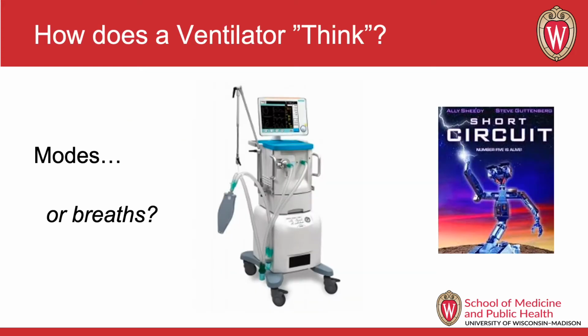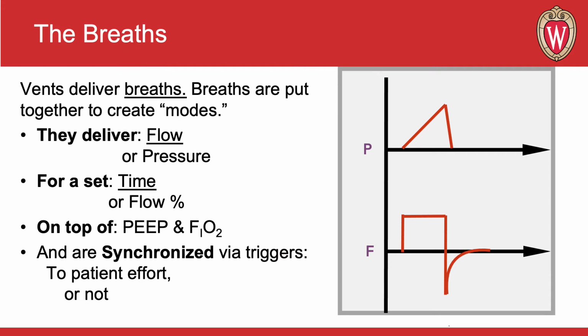Now, a ventilator doesn't think in terms of modes, and yet for some reason we teach vents in terms of modes. Today, I'm going to encourage you to not think in terms of modes, which change names based on the brand of ventilator you're using. I want you to think in terms of breaths, and ventilators think in terms of breaths. They do not think much about modes. And vents, as they deliver these breaths, put them together to create the modes.